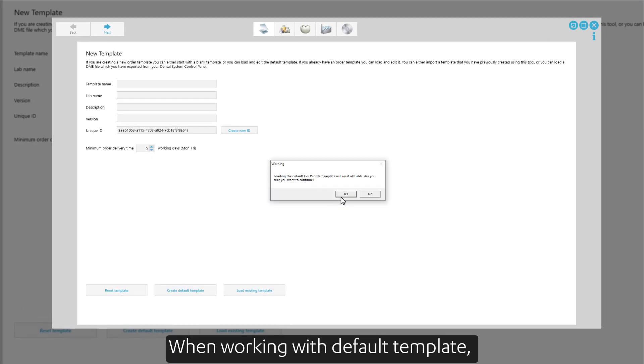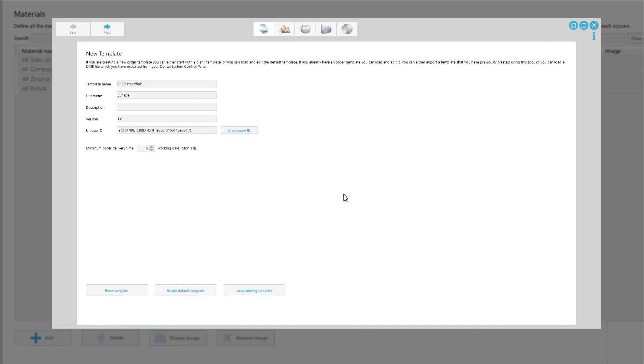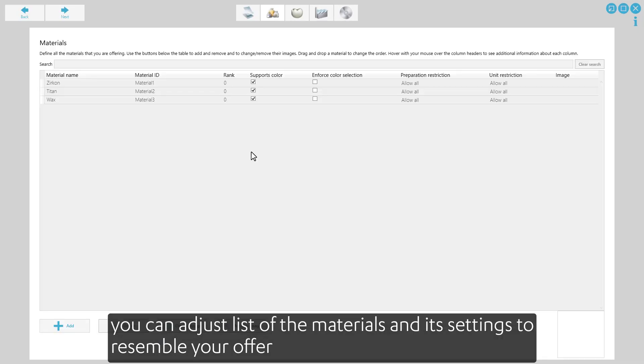When working with a default template, you can adjust the list of the materials and the settings to resemble your offer.